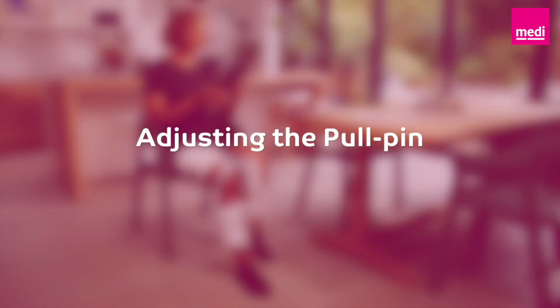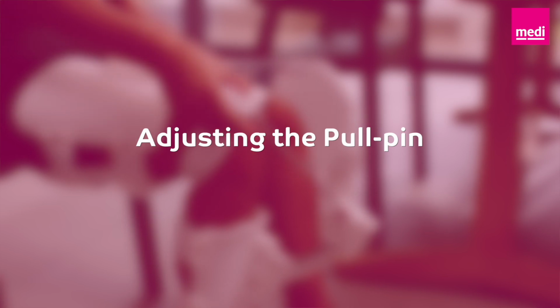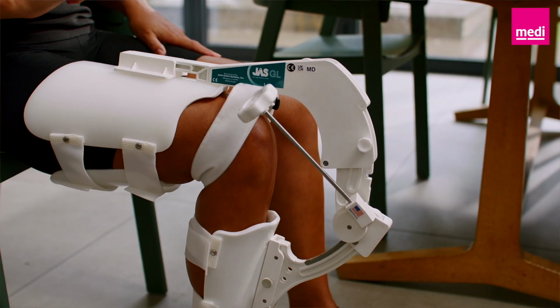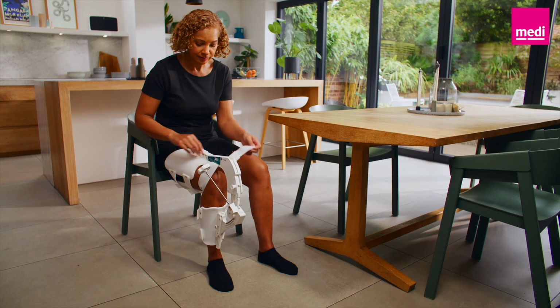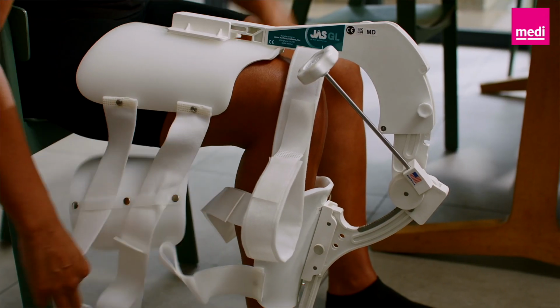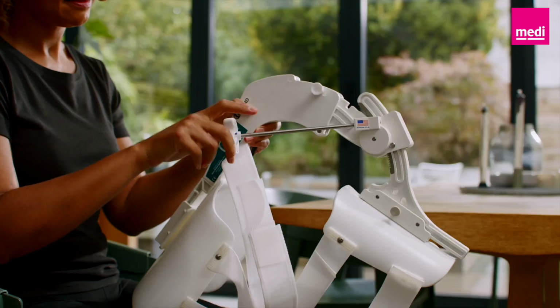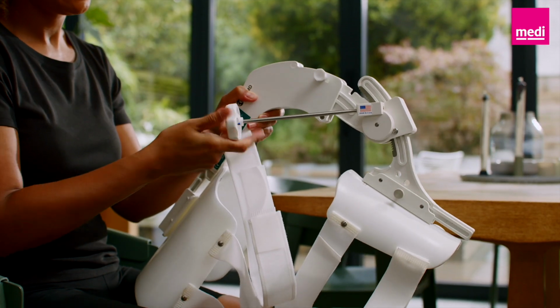Adjusting the pull pin. As you progress with your JAS therapy, you may find you can no longer turn the therapy knob. This likely means you've reached the end of the stretch range and it's time to move on to the next pull pin setting. You can do this by removing the brace from your leg and winding back the therapy knob.